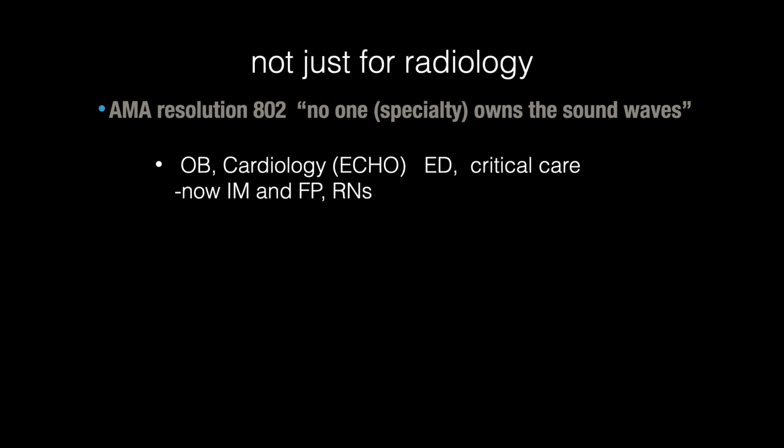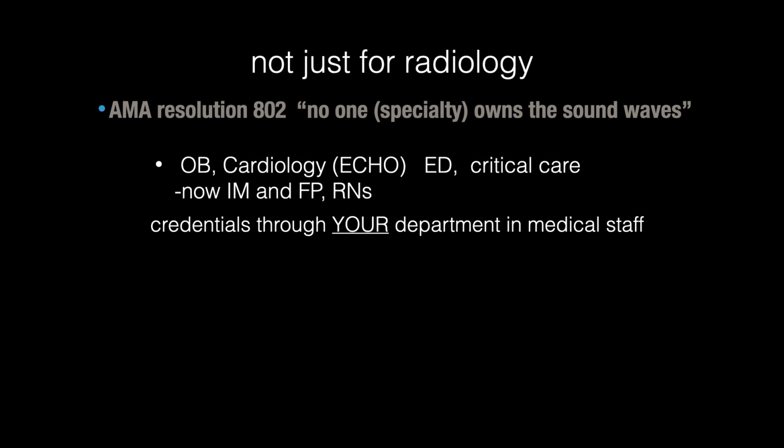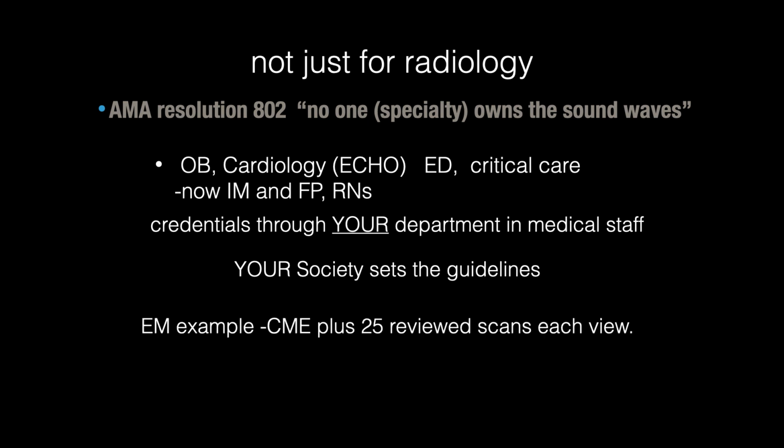One thing about point-of-care ultrasound is obviously it's not just for radiology and cardiology now. The AMA made a resolution called 802 that said basically nobody owns the sound waves. So each department really determines what the scope of practice of POCUS is within your specialty, and your credentials come through your department. I'm in internal medicine, so my credentials and scope come through internal medicine. I can't decide what OB does, or cardiology can't decide what radiology does. Each one of these is set up by guidelines within our societies.